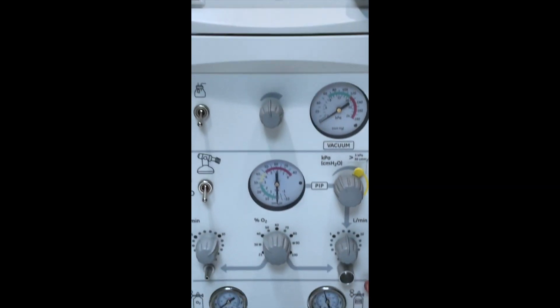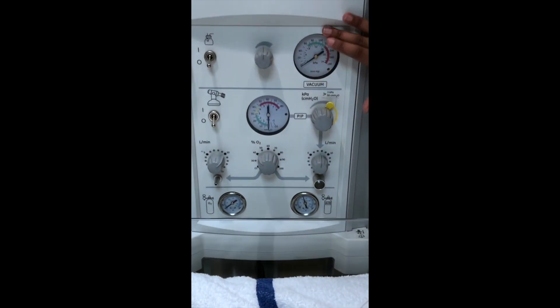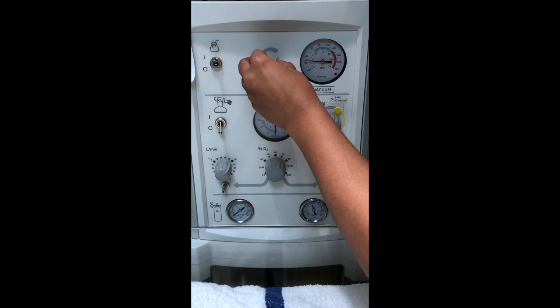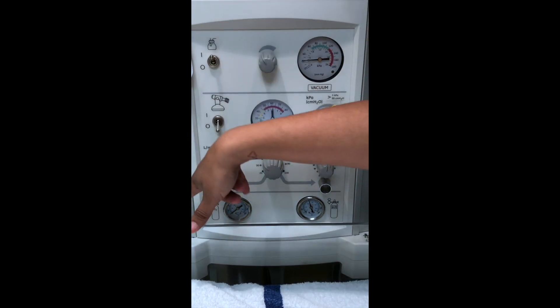Going down here, these are your monitors. Up here above the gray is your suction — you could turn it on and adjust the suction. Your suction canister is on the side.